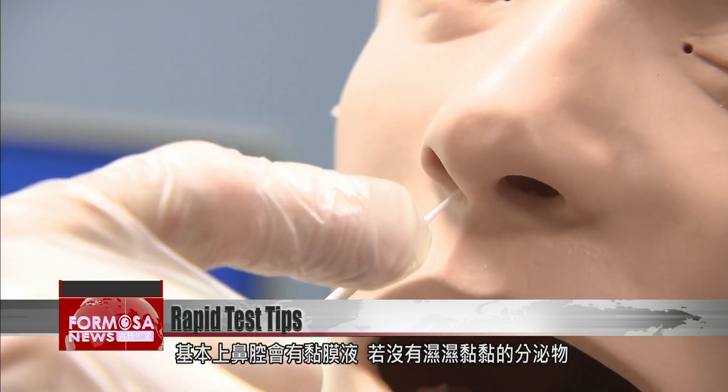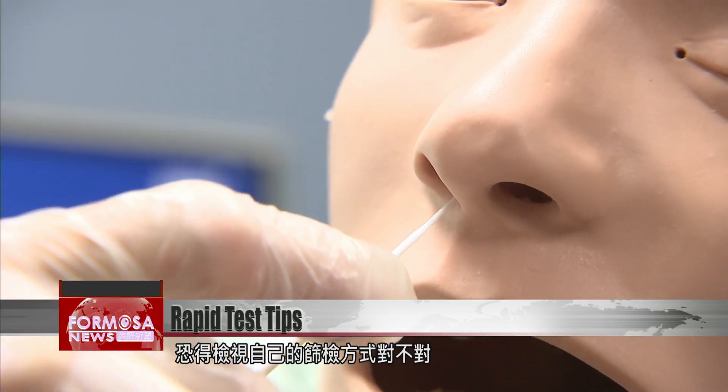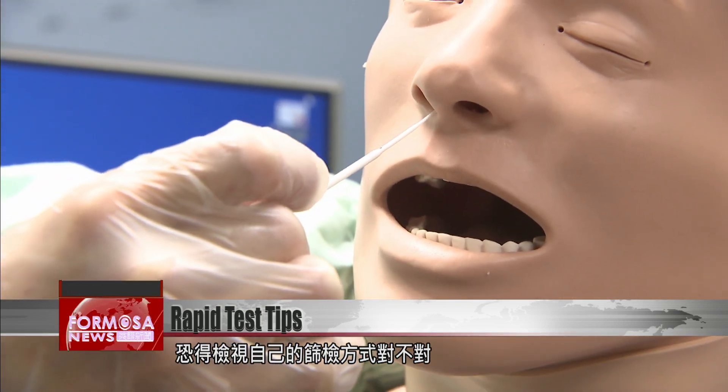The nasal cavity is covered in a mucus membrane, so if the swab comes out clean, it could be that the test was administered incorrectly.